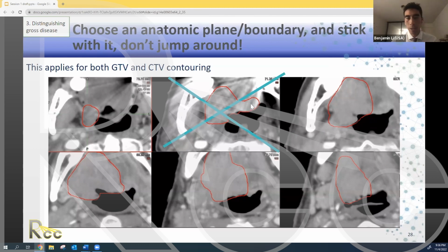And we have a good question from Julie Jamnasi from Indonesia. Thanks, Dr. Lee and Dr. Paly. For IV contrast, wouldn't it be better to do IV contrast for post-op gyne and GI to identify lymph nodes, and then whether or not to extend to PAN? I'm not sure I know what PAN stands for, but if someone in the audience knows and can type it in the chat, that would be great. Para-aortic, okay. Thank you so much. Very good question.